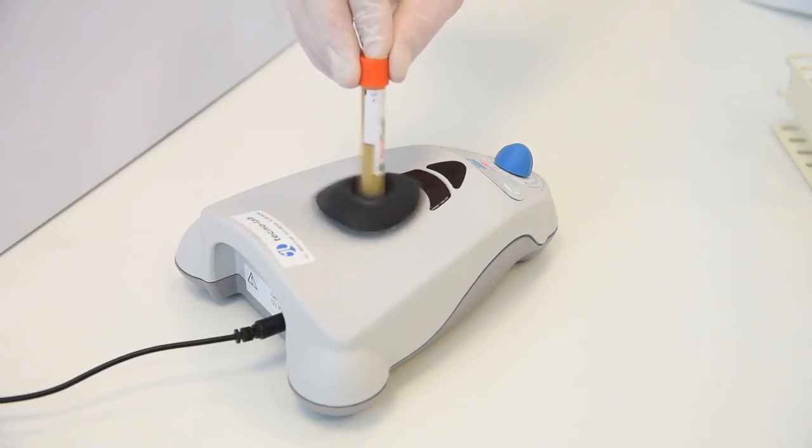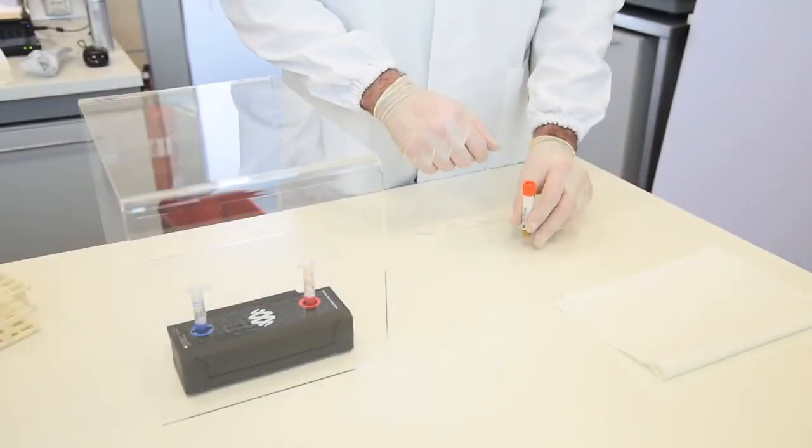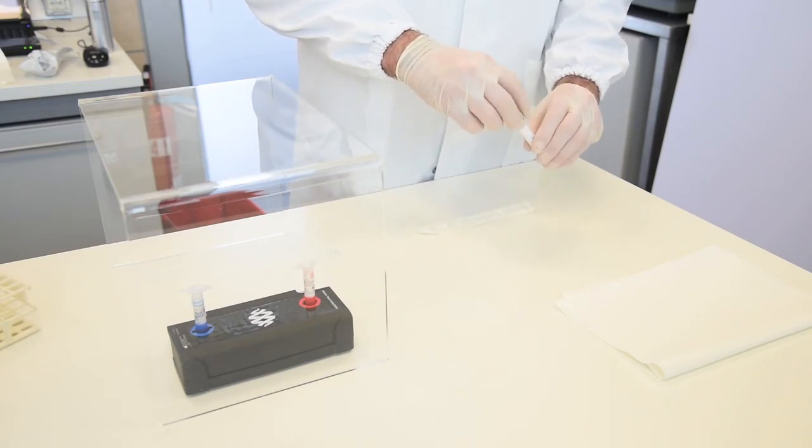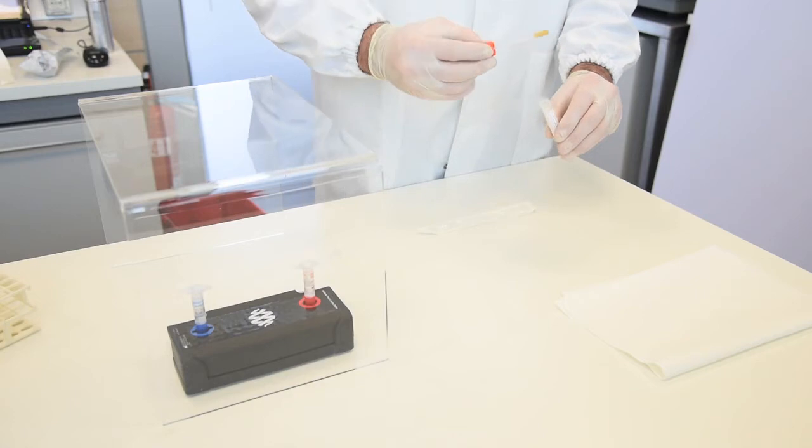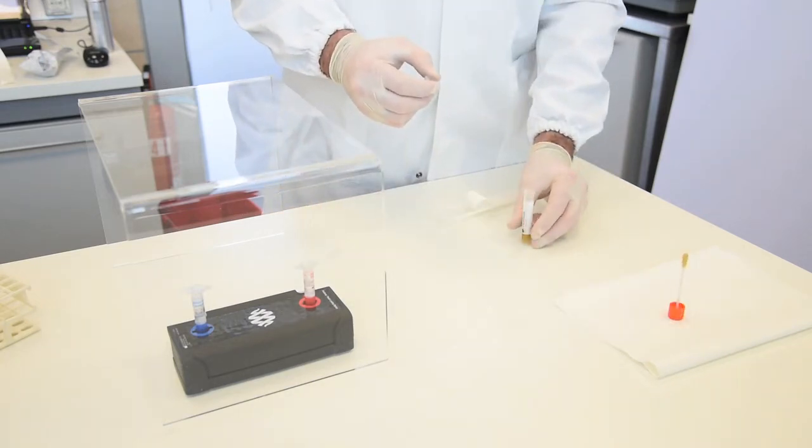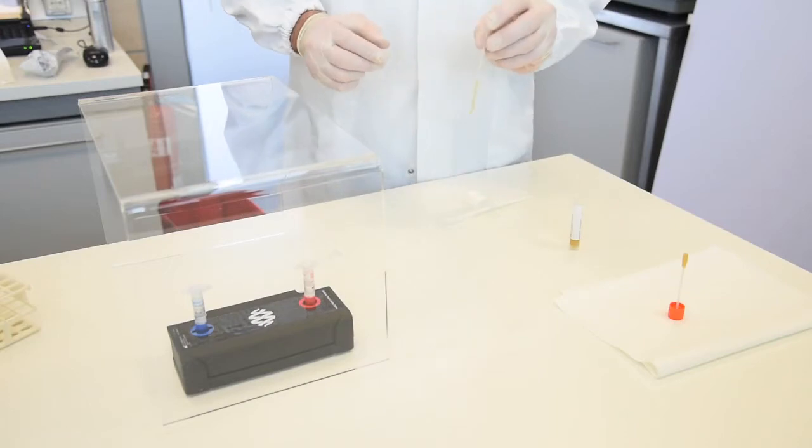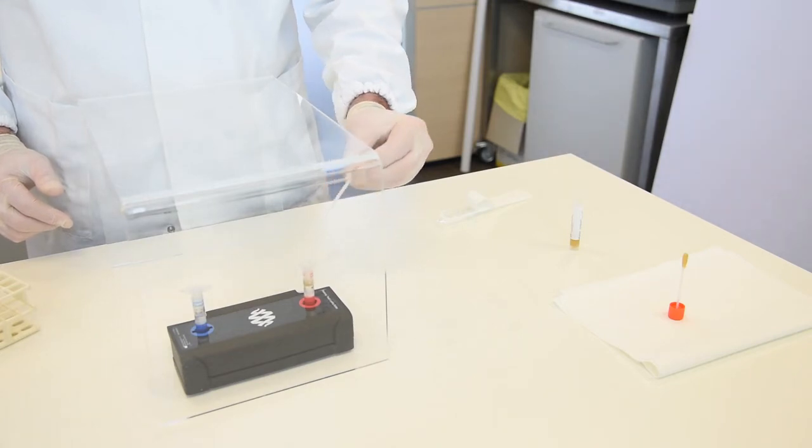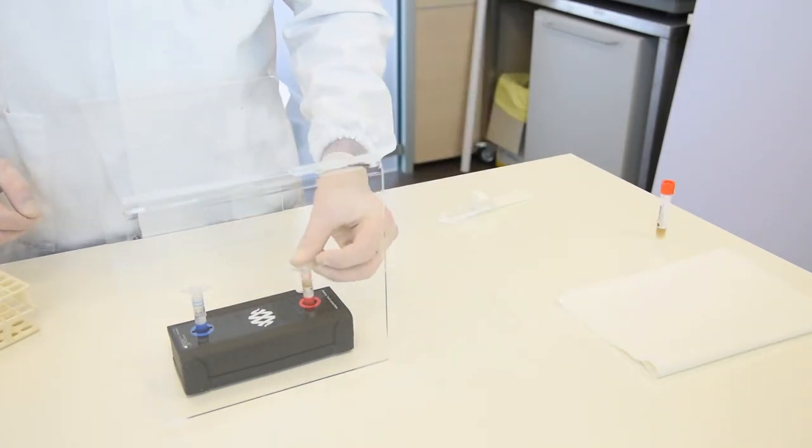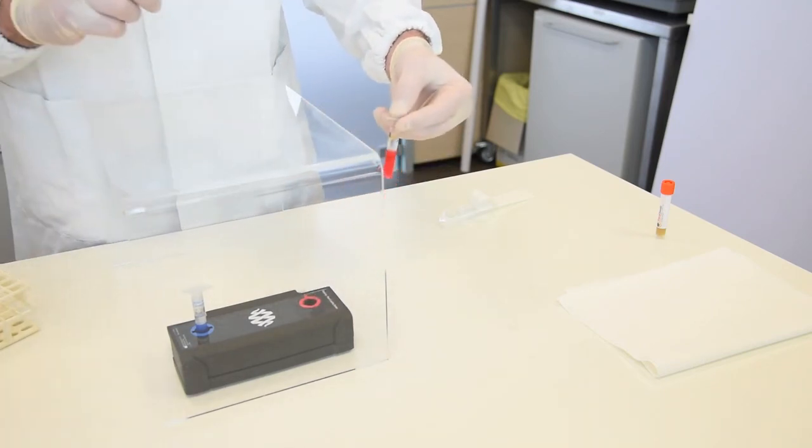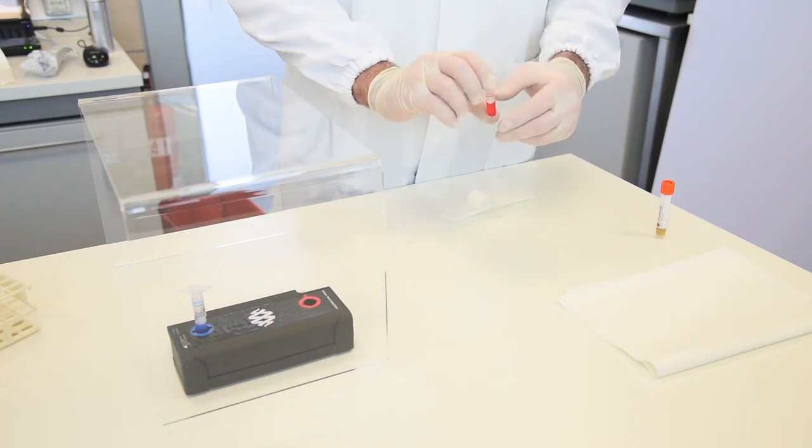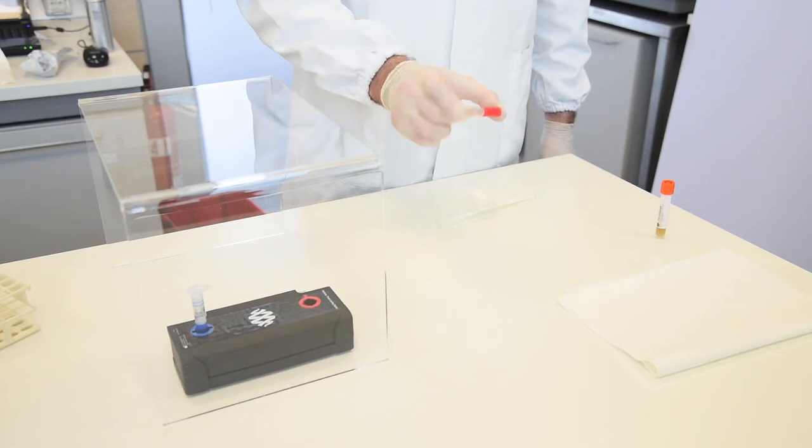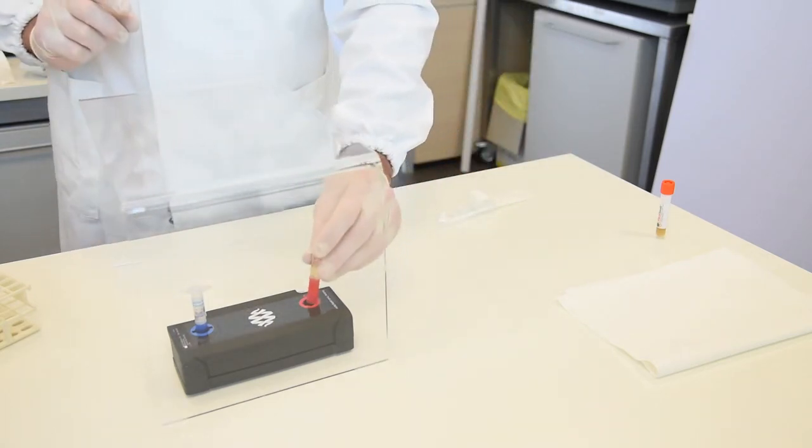Thoroughly mix stool specimen in transport media. Vortex fecal swab tube for 5 seconds. Remove cap and attach swab from fecal swab tube. Using transfer pipette, draw up specimen to second line. Add to sample injection vial. Tightly close lid of sample injection vial. Mix sample by gently inverting sample injection vial three times. Return sample injection vial to red well of pouch loading station.